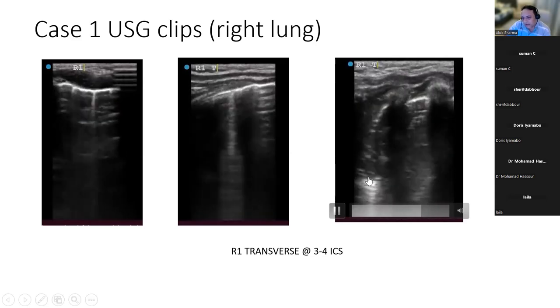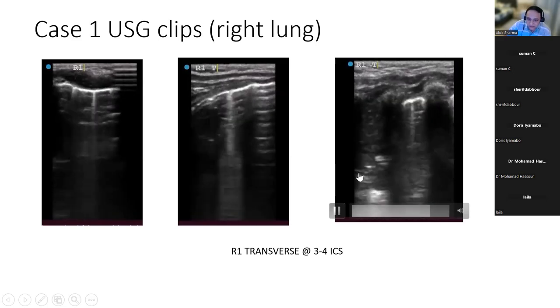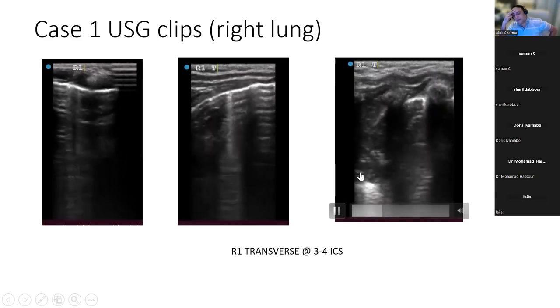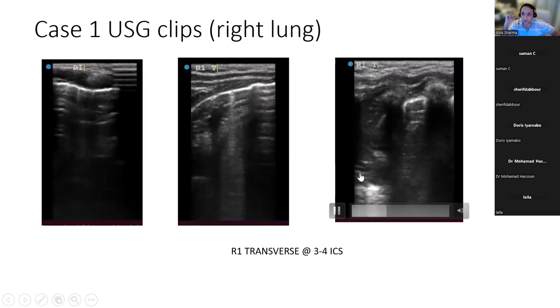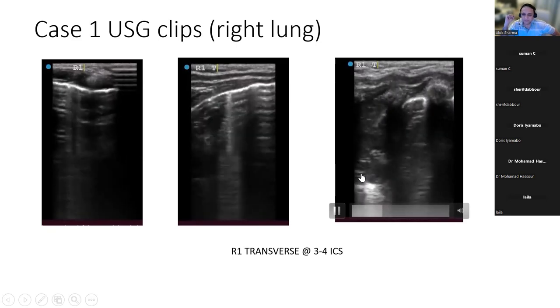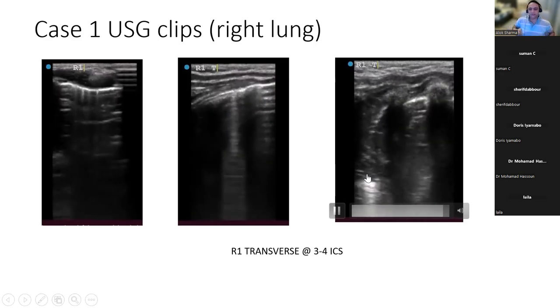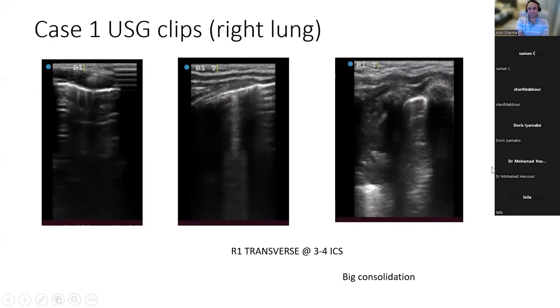Can you see that horizontal line there? Just to the left, to the left. There, that's a blood vessel. The one thing that I would definitely have done is put a Doppler on this area. I tried doing that. That's in the next slide. Okay, let's have a look at it. I need to keep my hand stable. That is one thing.